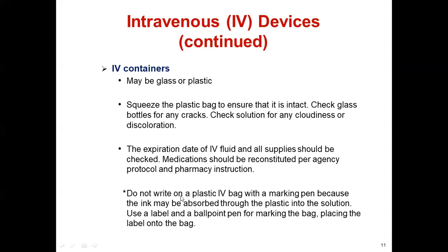Do not write on a plastic IV bag with a marking pen, because the ink may be absorbed through the plastic into the solution. Use a label and a ballpoint pen for marking the bag, or place the label onto the bag.